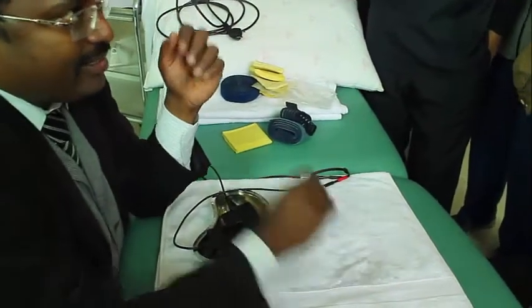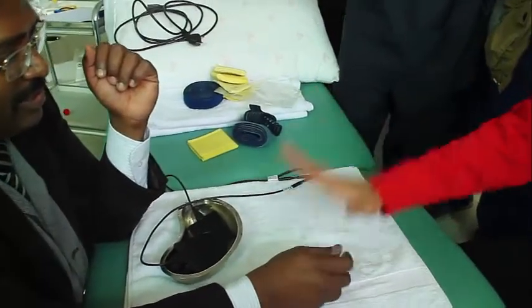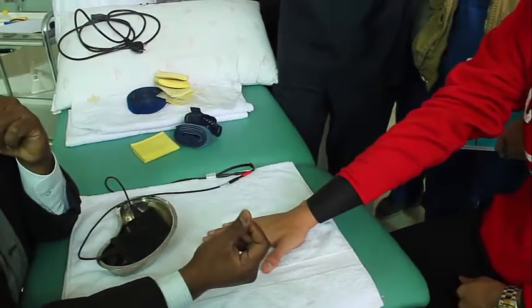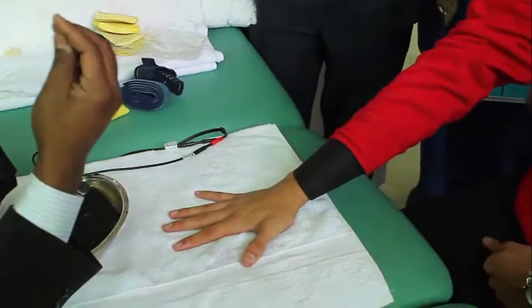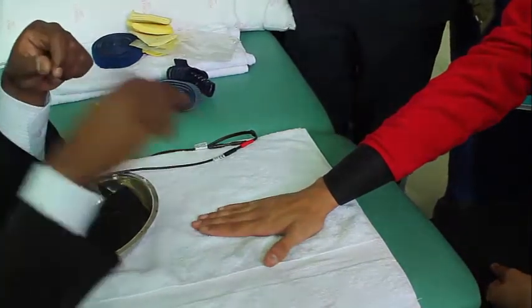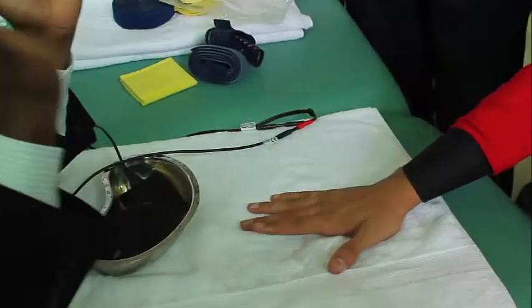Can you keep your hand here? Yes. Can you remove this thing? Yes. So when you want to stimulate the skin, as I told, skin is a dry material. It has oil and it has dirt inside it. And skin pores are usually not conductive for the electrical charge. They are all insulators for electrical current.